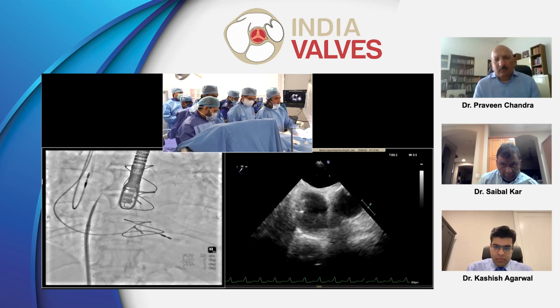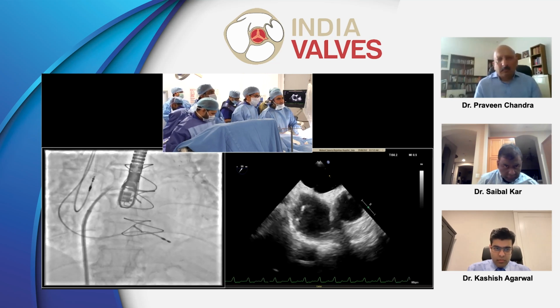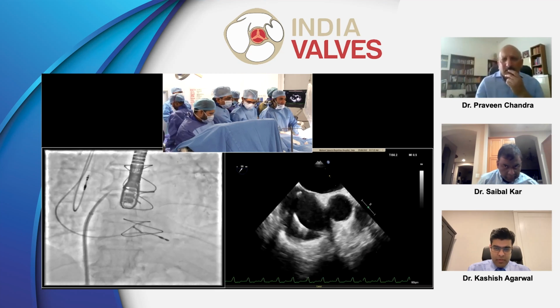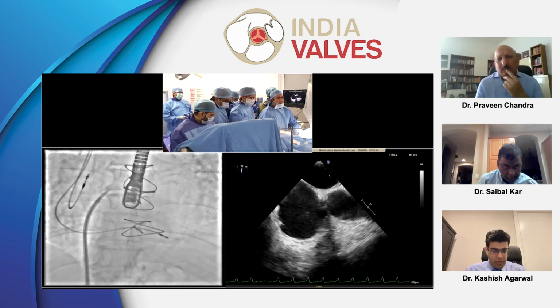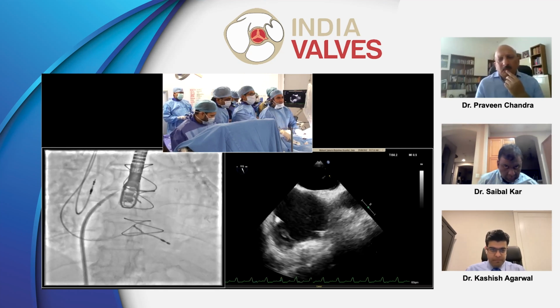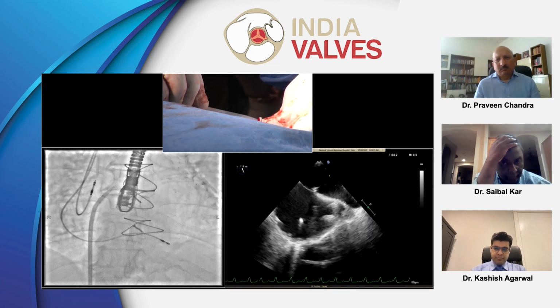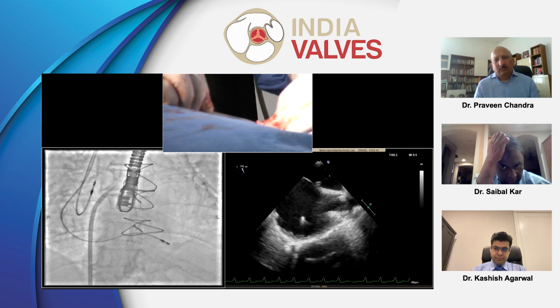I'm going to go ahead and advance this. Did this patient have a septal repair or something? No, I don't think so. Very high puncture. Yeah, very high. It's close to the high part of the fossa.